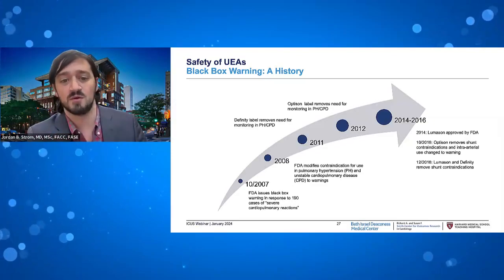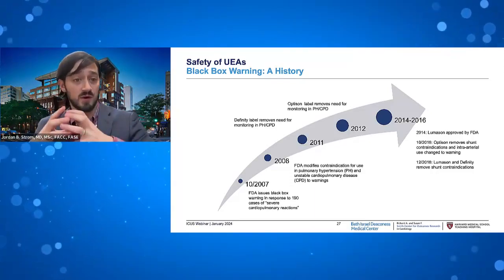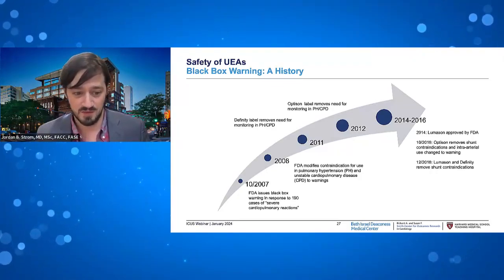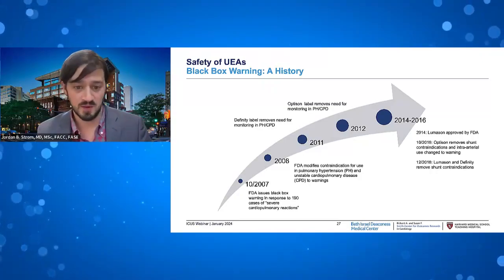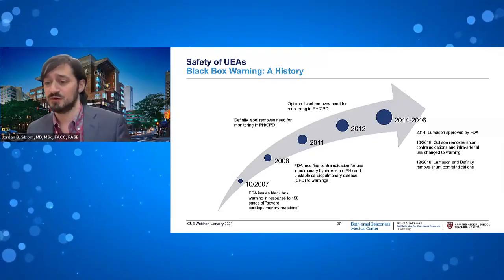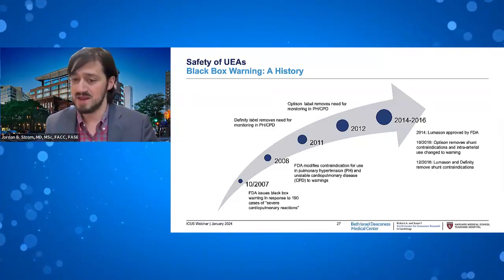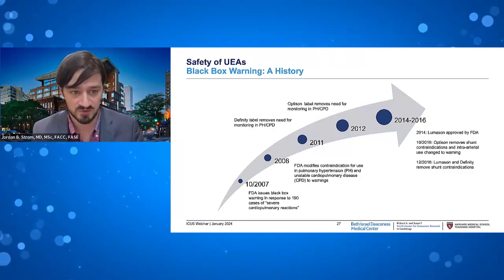And we know the theoretical risk in the setting of an intra-arterial shunt is that some of these microbubbles might clump together and therefore obstruct the vascular bed. We know, for example, that the vascular bed is so large that it's very unlikely to happen. Those bubbles break up and are showered into the tree branches of the vascular bed, so it's unlikely to cause a large embolism. And that is also the concern in use in pregnancy. There's less data on pregnancy. In particular, the concern is a theoretical risk of placental arterial occlusion. But in reality, many centers that have experience with use in pregnant patients, including our own, have not seen this, at least on a small scale.